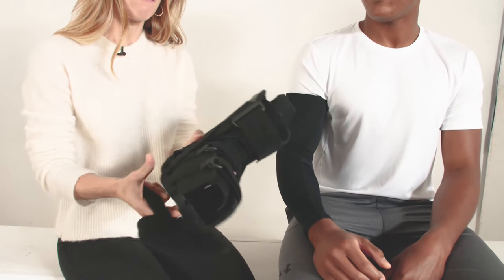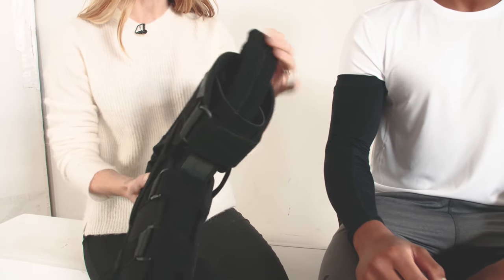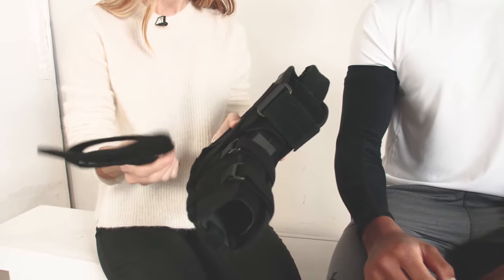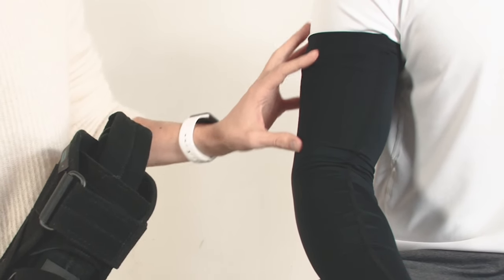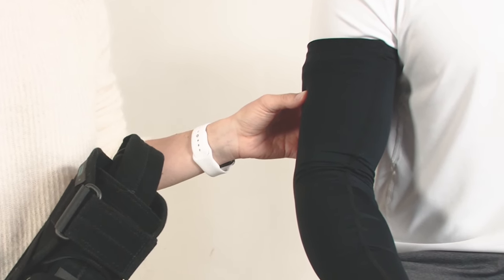When you receive your brace you're going to have the product itself with an accessory sling inside, as well as a handpiece. Today we're going to demonstrate with this elbow sleeve already in place, which is an accessory that you can also purchase from Healy & Weber.